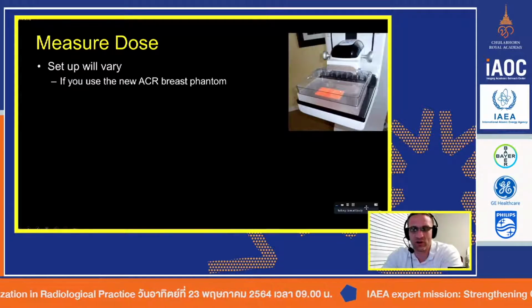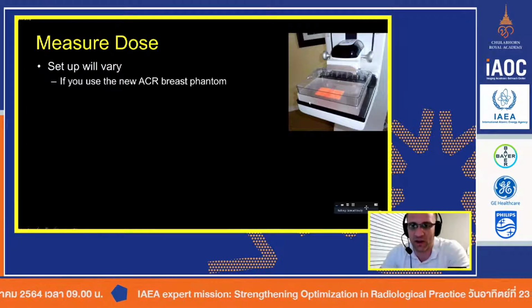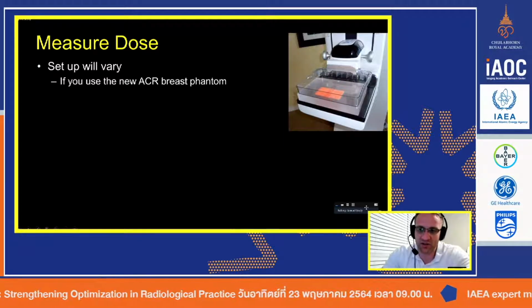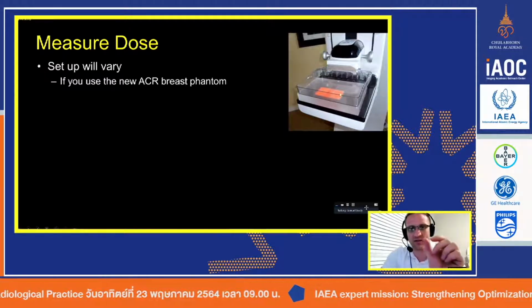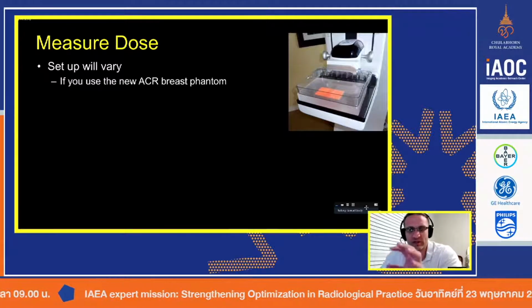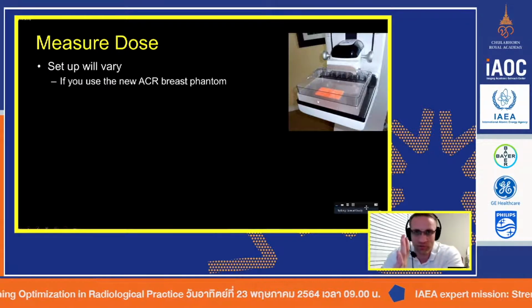So when you do your image quality assessments, you don't have a teeny Phantom inside a big white field. Because the Phantom now covers the full field of view, the dynamic range of the system is better. And also, because we're using digital detectors now, we needed a Phantom that had smaller masses and less contrast in their targets, so that we could truly see how good the system is. The older square, smaller Phantom was developed back in the day when all mammography was film.